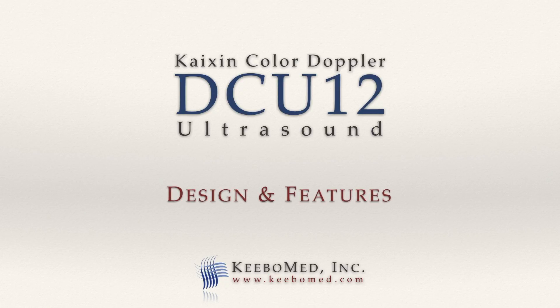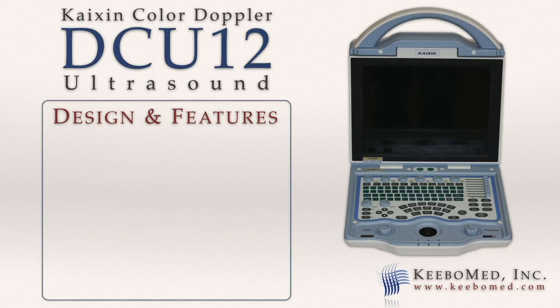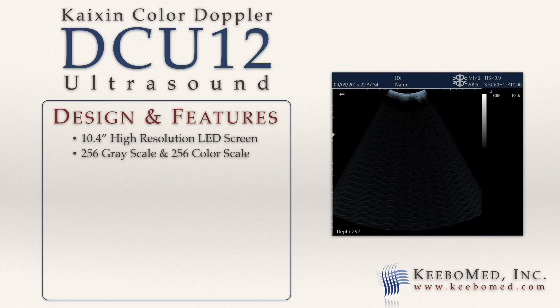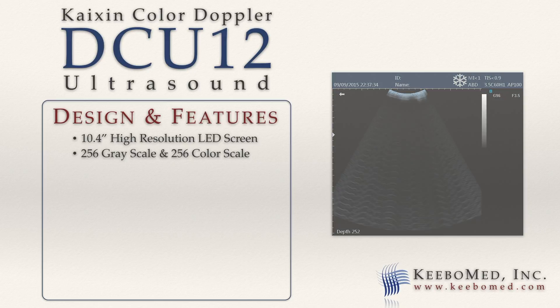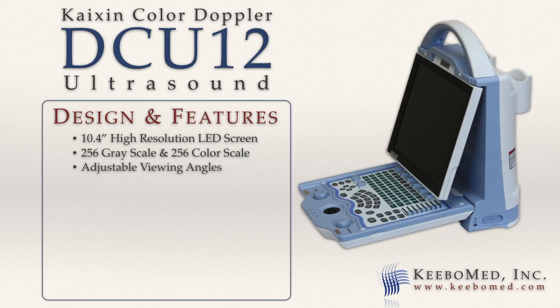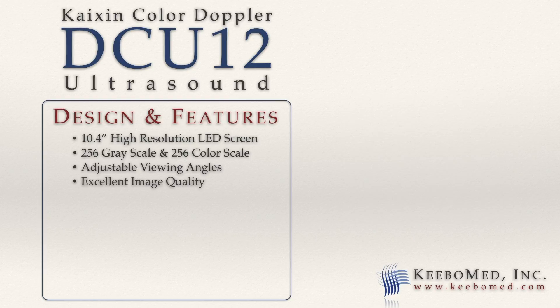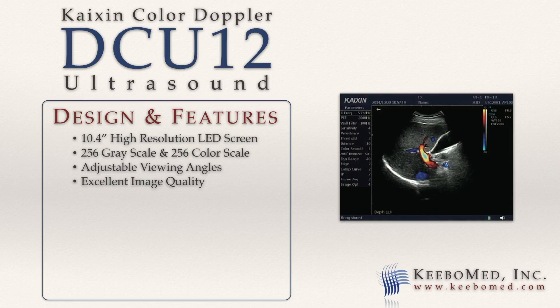The design of the DCU-12 allows for convenient use and its many features provide much adaptability. The screen is a 10.4 inch high resolution LED. It has a 256 gray scale and a 256 color scale. The angle can be easily adjusted to achieve the best view. The image quality is excellent, comparable with ultrasounds that cost $10,000 and up.